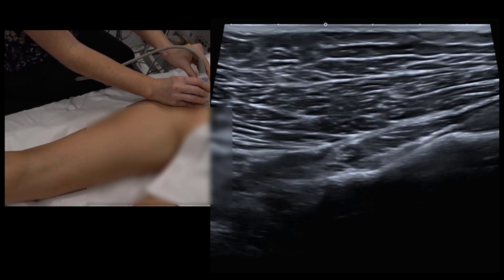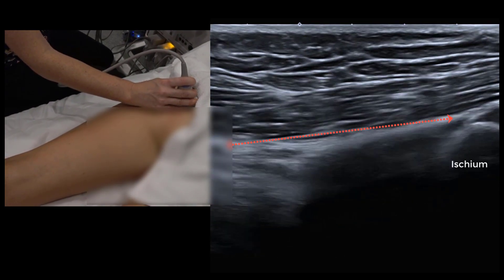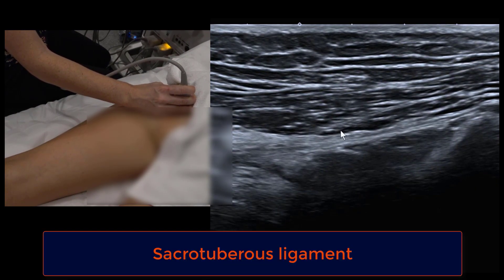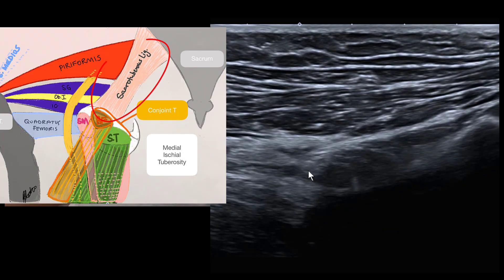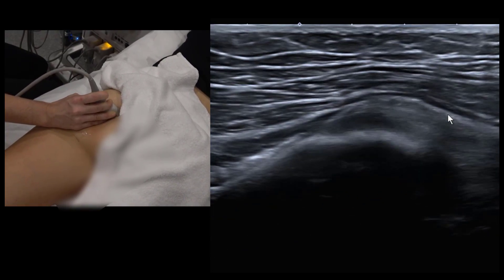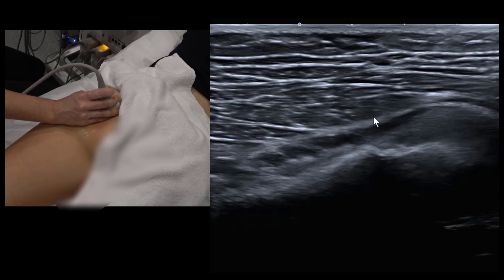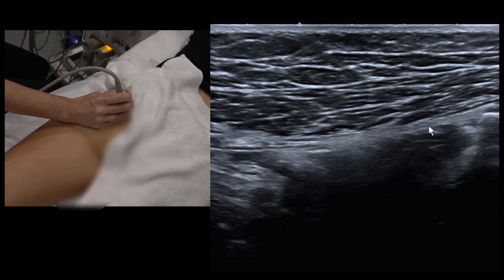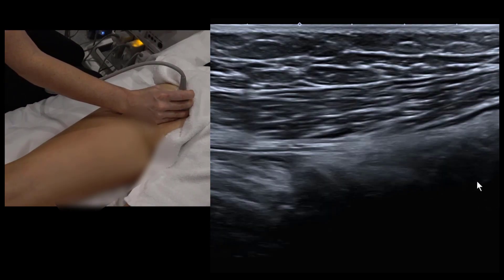Moving a probe-length superior to the ischium and rotating so the superior end of the footprint points towards the sacrum brings the sacrotuberous ligament into view. The neurovascular bundle passing underneath it is the pudendal nerve. Some people have a high hamstring origin where fibers originate along the sacrotuberous ligament, and the ligament itself can be anatomically thicker on one side — so comparison is key.